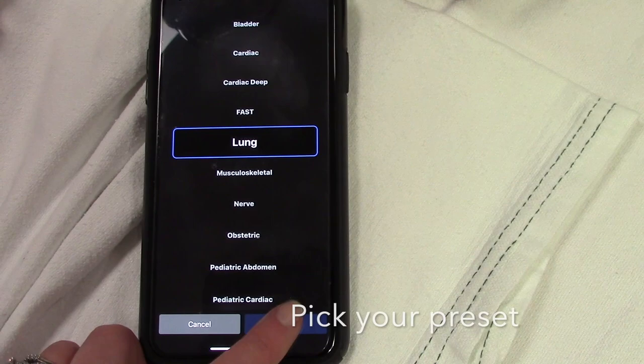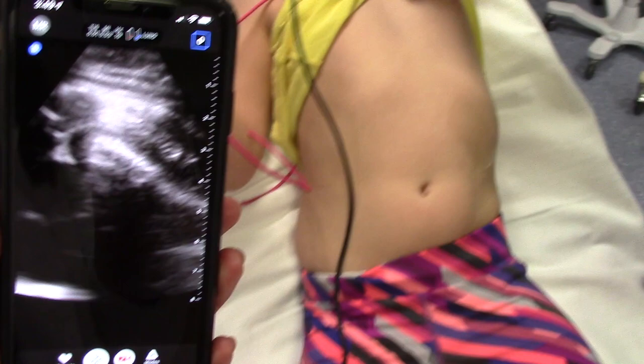There are lots of other modes you can use for the handheld ultrasound, but essentially what we're going to do is go through the lung fields now and show you a couple of things via ultrasound with the handheld.